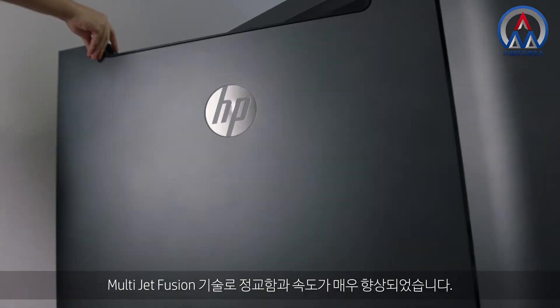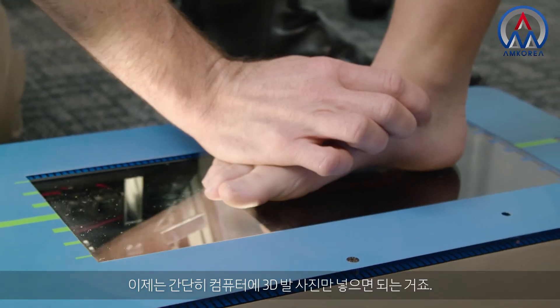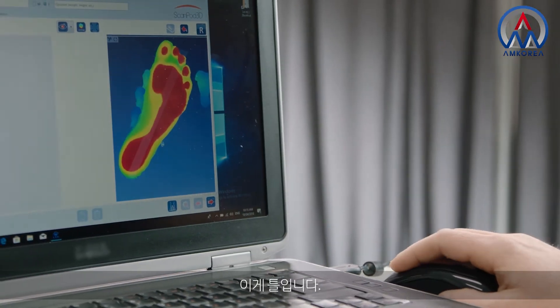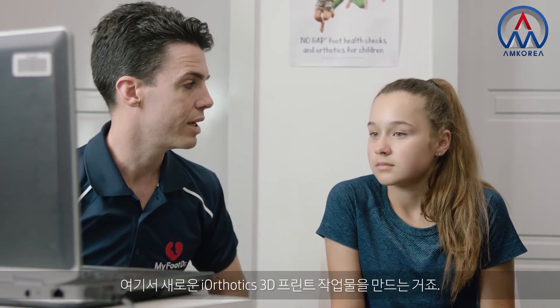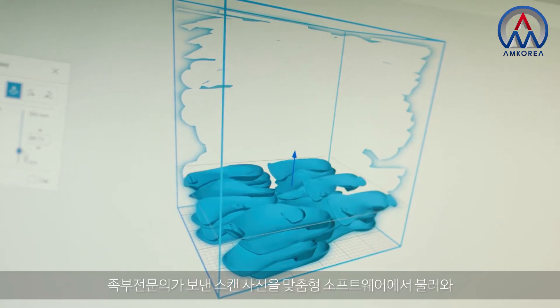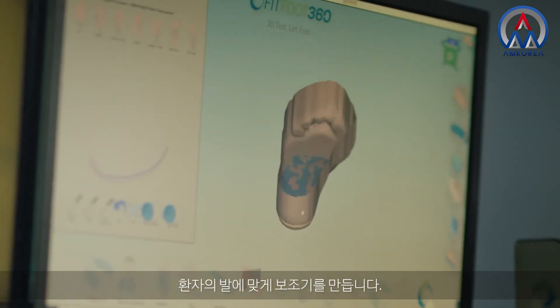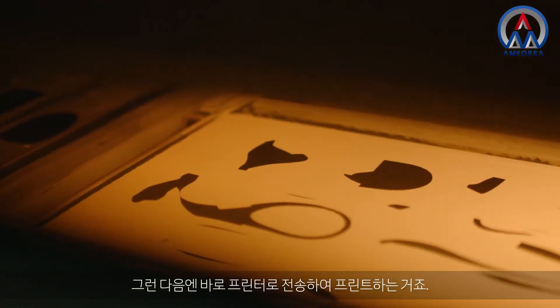The benefits of the MultiJet Fusion technology is it's more accurate and faster. Essentially what we have on the computer now is a three-dimensional photograph of your foot, and this is the mould. From here, this is where we get your new iOthotic 3D printed. Once we receive the scan from the podiatrist, we import that into our custom software. We then make the orthotic to the patient's foot, and from there we can instantly send it to the printer to be printed.